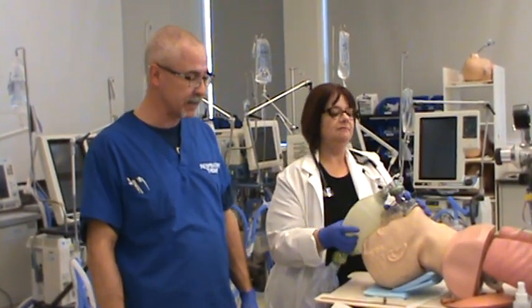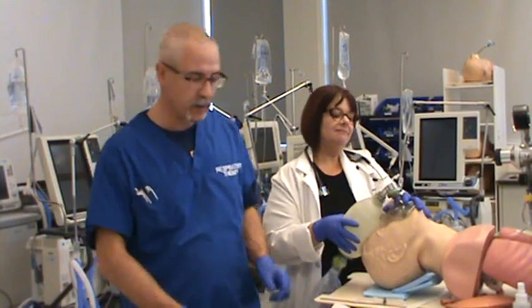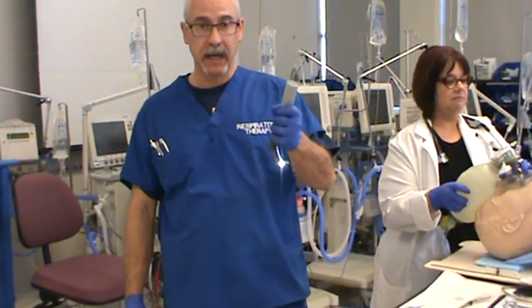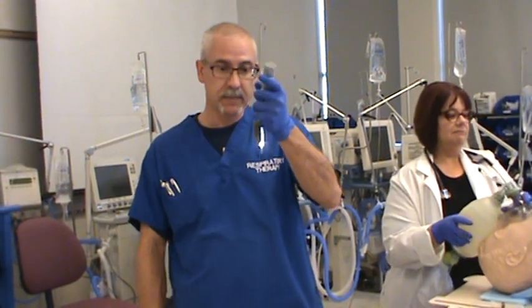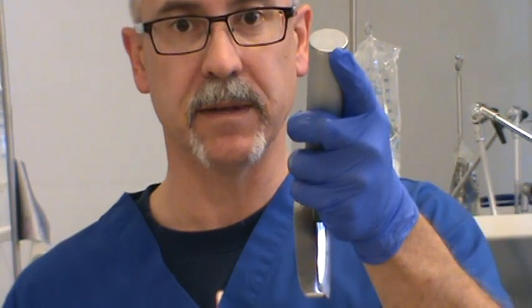I want to show you a couple of techniques that might make it a bit easier to insert the tube. First of all, how you hold the blade. Grab it in your left hand, and remember the technique for inserting is going on the right hand side of the patient's mouth and swooping over the tongue, placing the tip into the vallecula as you do so, and then moving upwards and forwards with the blade to visualize the glottic opening.